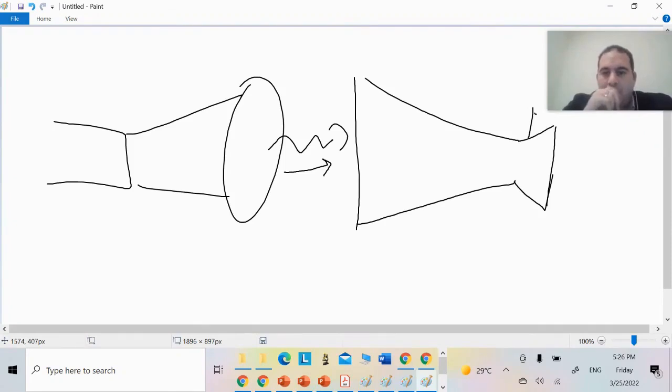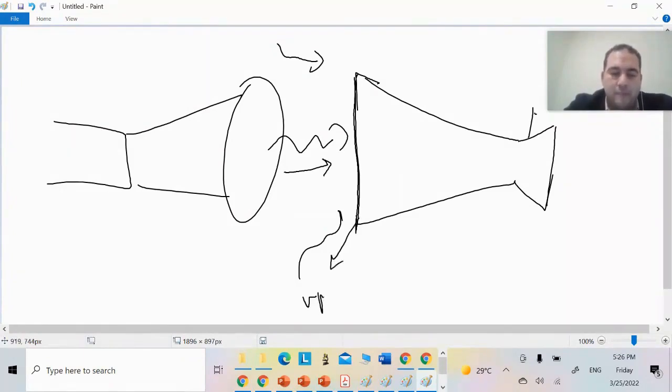We create it and place it on the exterior, and we make it from a material such as aluminum. Why? Because it is important that nothing from the outside enters, but it allows a bit of scattering so that the X-ray photons can enter through the input window, which is the primary input window. Then it is received by something, so I will get something that is the input phosphor.